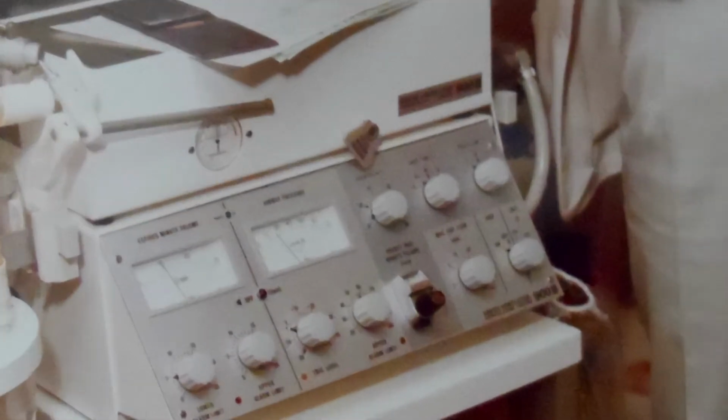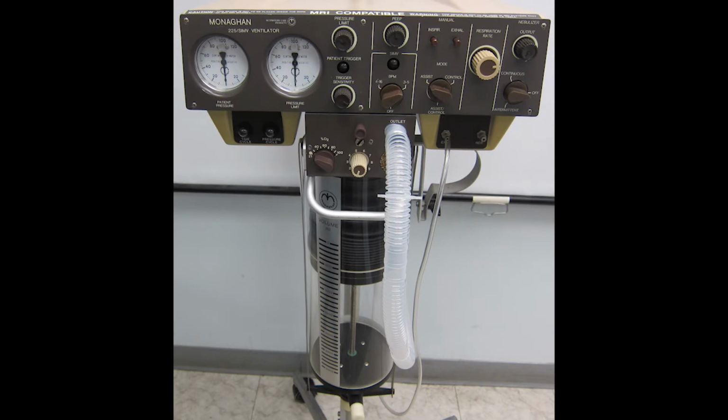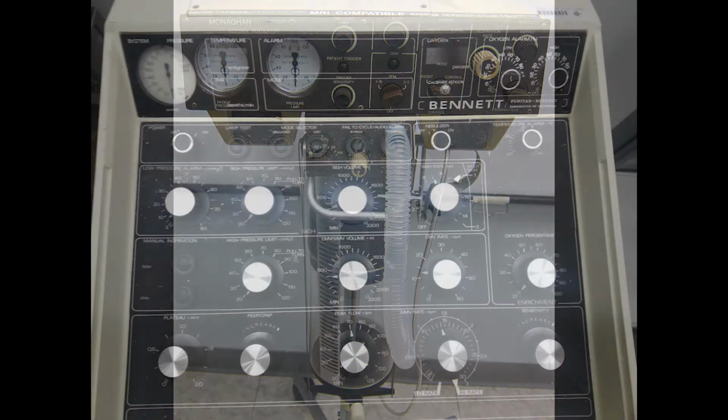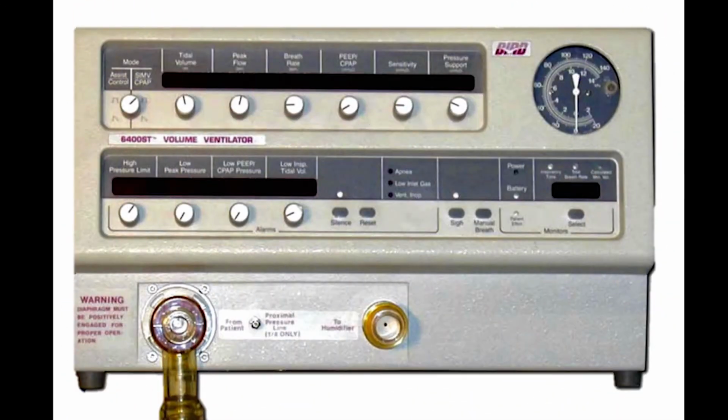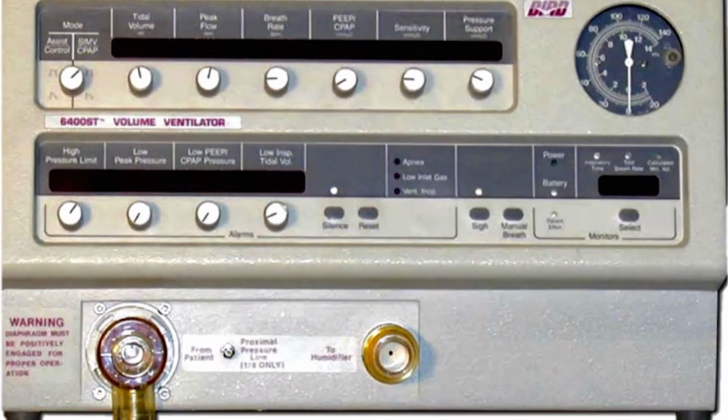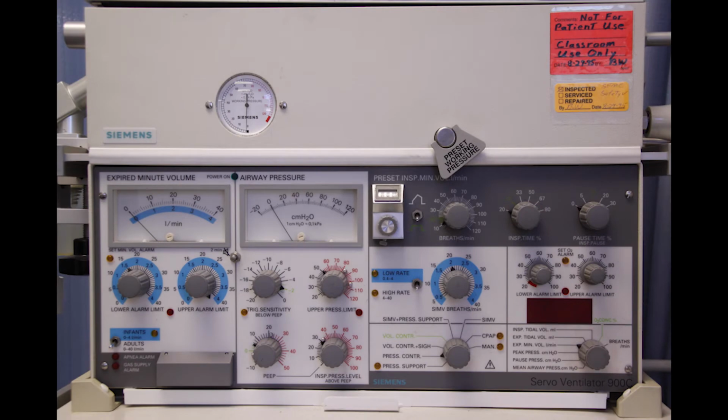Late second generation ventilators added a demand valve that allowed patients to trigger breaths. They also had the ability to do IMV with the use of an external gas source. The Servo 900C, a late generation ventilator, allowed the use of pressure support and pressure control ventilation.